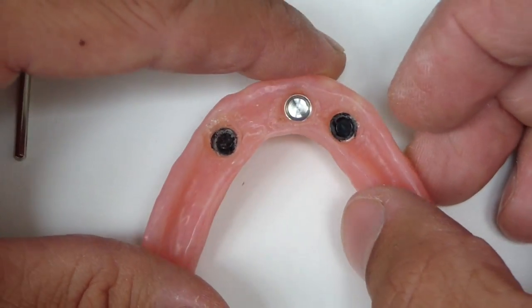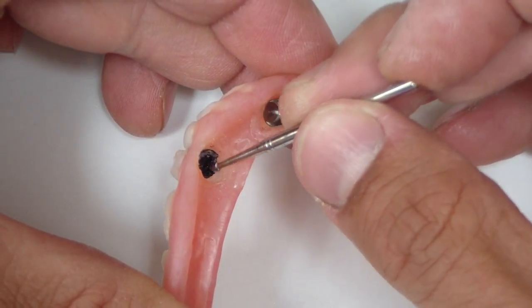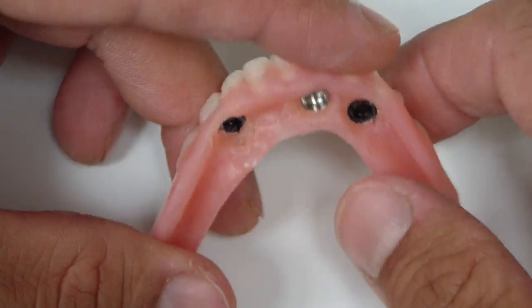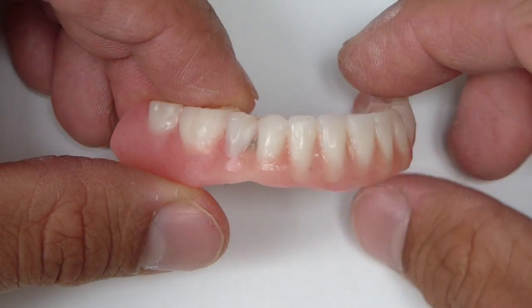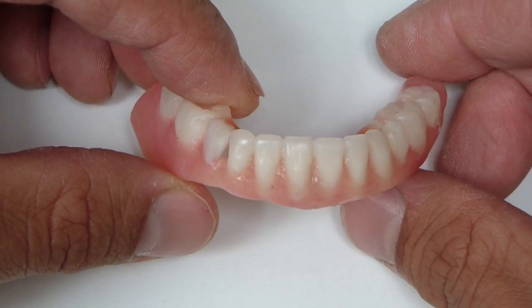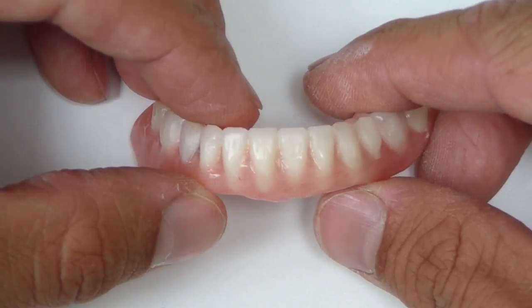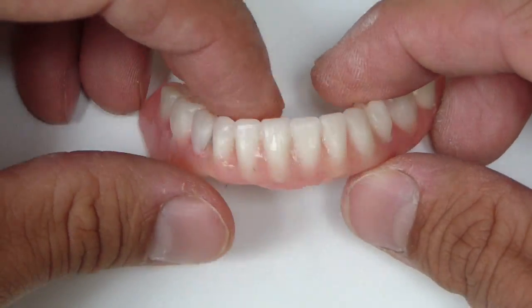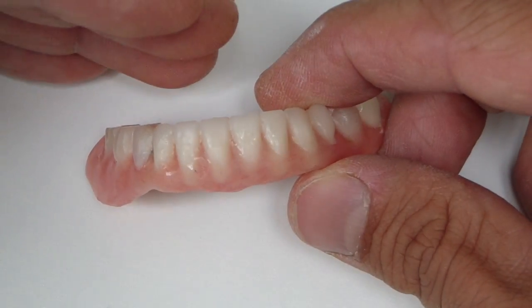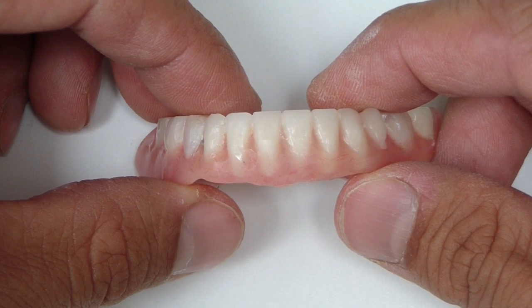You can see here the depth of where that implant now rests and how that affects the aesthetics — you can actually see some show-through. Is this a major aesthetic problem? No, it's a mandibular denture in this patient and you don't see it. But if this is a consideration — if you're doing these in the maxilla or any other patient — with age, the lip smile line slowly goes inferiorly.